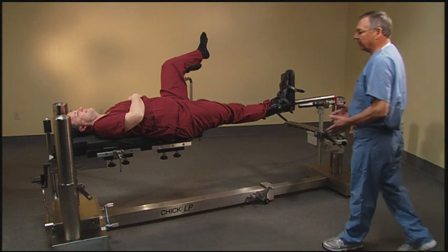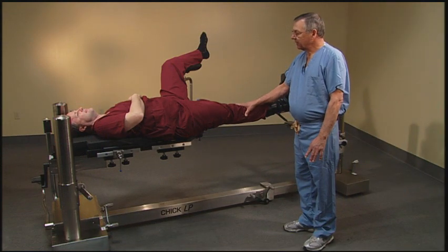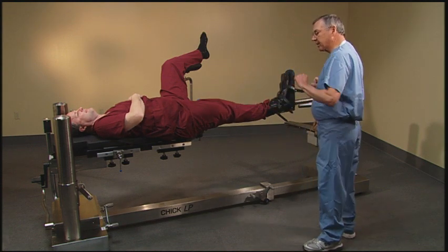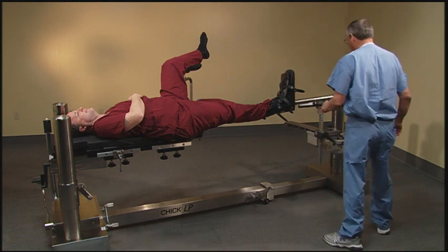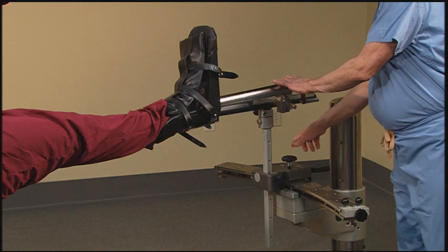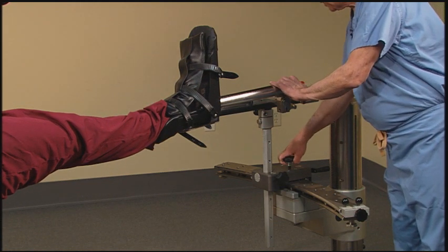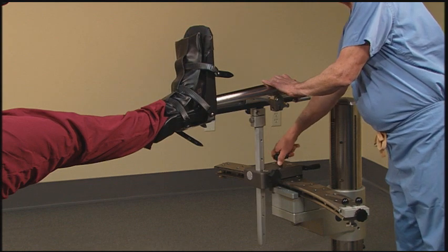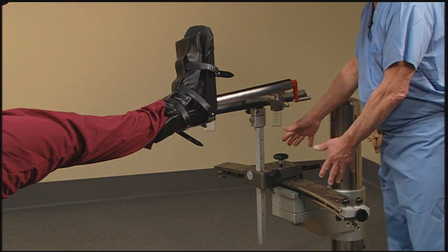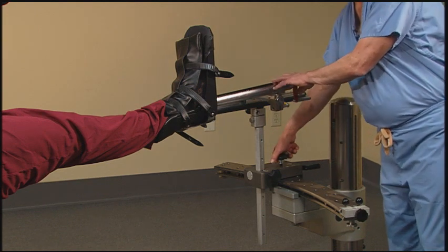What you see here is a typical setup for a fracture repair of the hip. The setup for repairing the femur is identical, except we always take the drape rods off, and the surgeon may want to adduct across midline. Adduction for femoral surgery can be achieved by loosening the knob on the traction block and moving the traction unit across the arc. The traction arc is also designed to maintain the same amount of traction regardless of how much adduction or abduction is achieved.